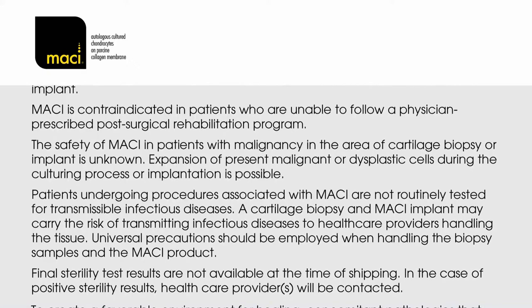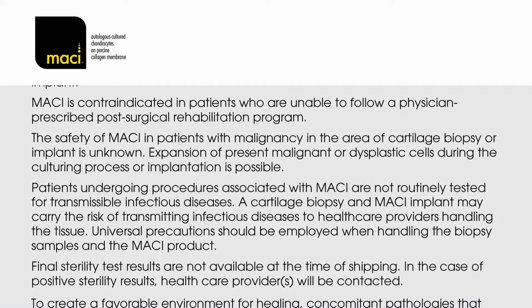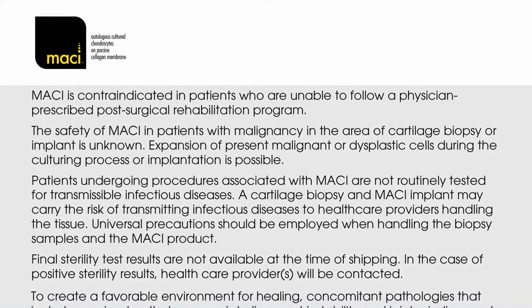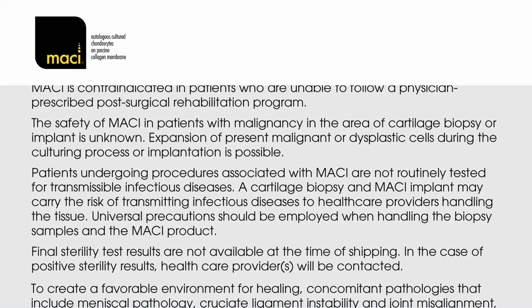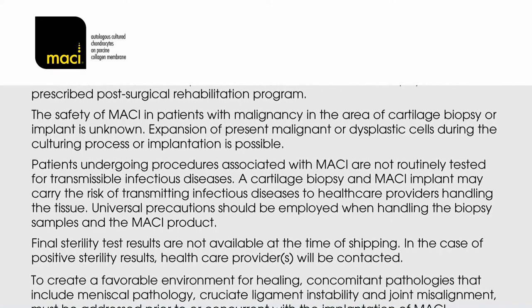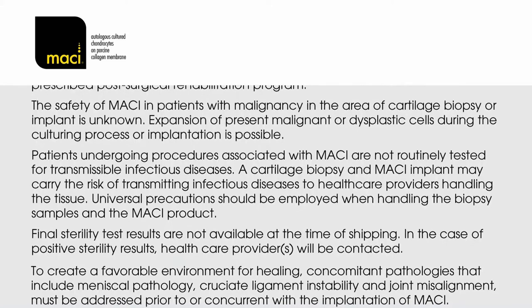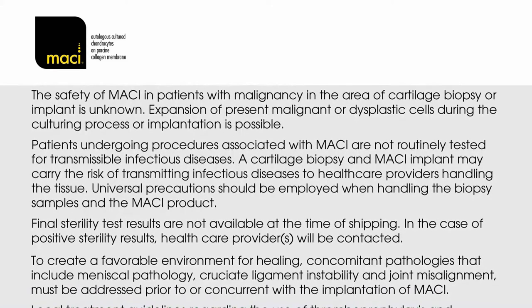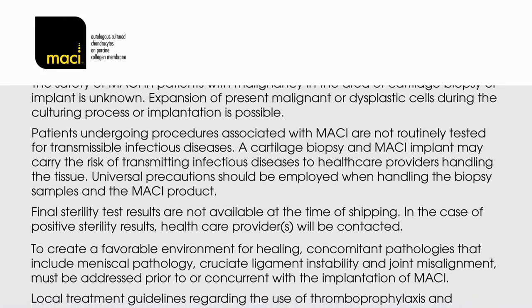Patients undergoing procedures associated with MACI are not routinely tested for transmissible infectious diseases. A cartilage biopsy and MACI implant may carry the risk of transmitting infectious diseases to healthcare providers handling the tissue. Universal precautions should be employed when handling the biopsy samples and the MACI product. Final sterility test results are not available at the time of shipping. In the case of positive sterility results, healthcare provider or providers will be contacted.